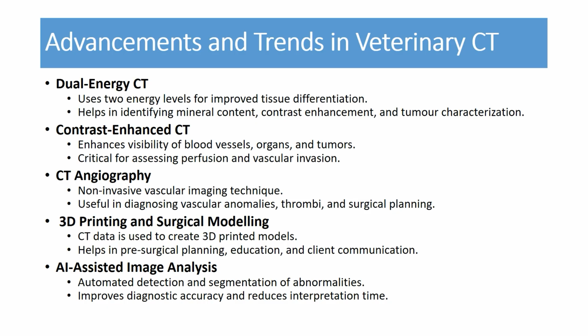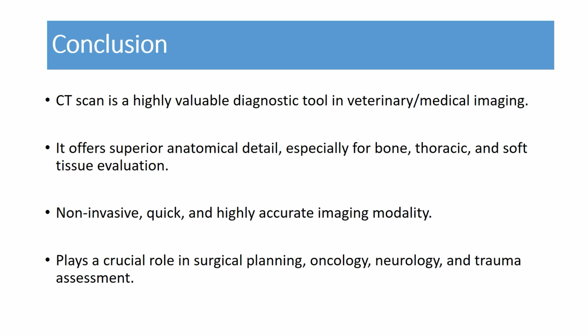Nowadays, CT machines come along with AI assisted image analysis, artificial intelligence assisted automated detection and segmentation of abnormalities, which improve diagnostic accuracy and reduce interpretation time. So these are certain advancements and trends in veterinary CT.